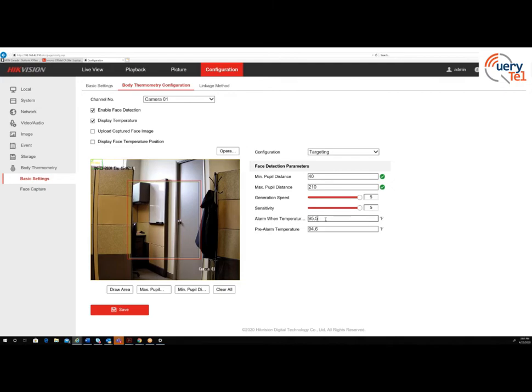So it's constantly sending email messages and creating false tickets on our portal. Let me change it back. 98 point. So this is the current. It depends what your settings are. And now it should show me green. I'm good. Excellent.